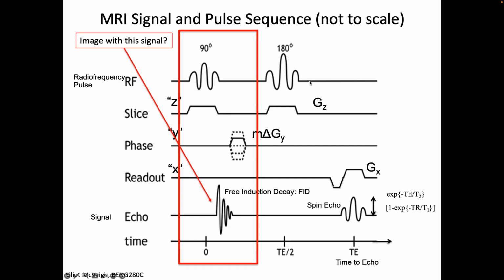If we want to do things a lot faster than this, we can go faster by a factor of, say, 10, just by saying, let's forget about all this business. We're going to do an RF pulse, and we'll just make our image from this signal. As soon as the magnetization hits the transverse plane and starts giving you signal back, we move all of these gradients that are used for imaging and shove them all into this small time space and make our picture inside here. That means that these gradients have to switch 10 times faster, right?